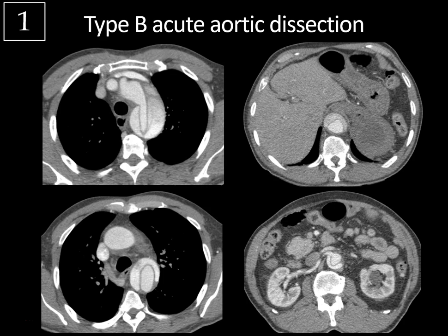The false lumen tends to form a beak — this is known as the beak sign. You can see this little beak extending towards the margin of the true lumen, and sometimes you'll get a little thrombus developing in that beak. You might also see the cobweb sign in the false lumen, where sheared bits of residual media appear as little ribbons. The false lumen also tends to be less opacified compared to the true lumen.